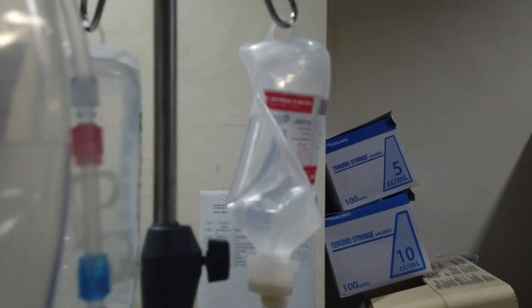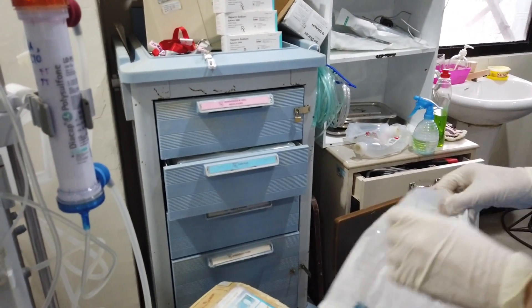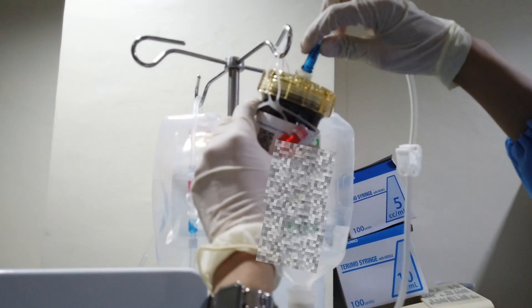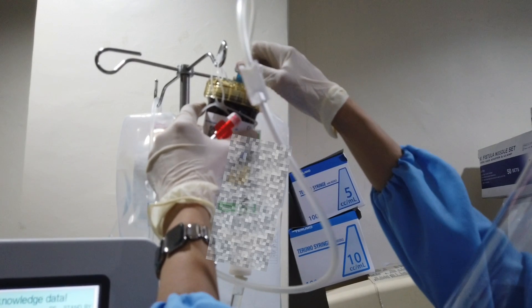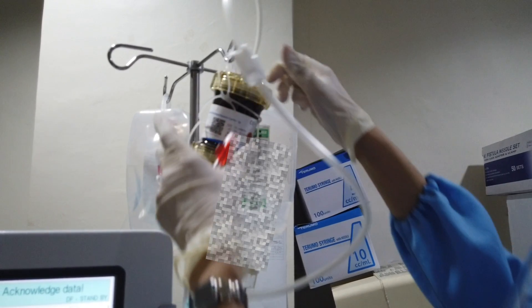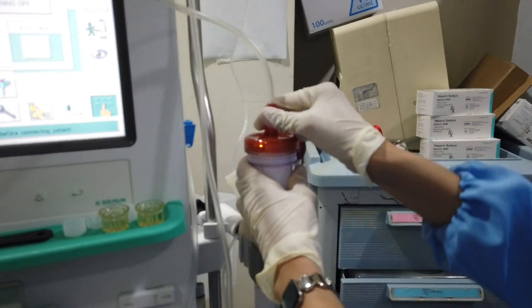Once consumed, stop the blood pump and change it to 1 liter PNSS. Open the connecting tube. Connect the blue end to the top of the cartridge. Before connecting the other end to the dialyzer, prime the connecting tube first by starting the blood pump and stop until it reaches the arterial end.